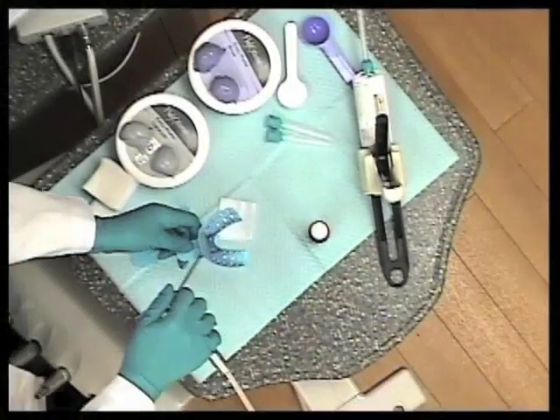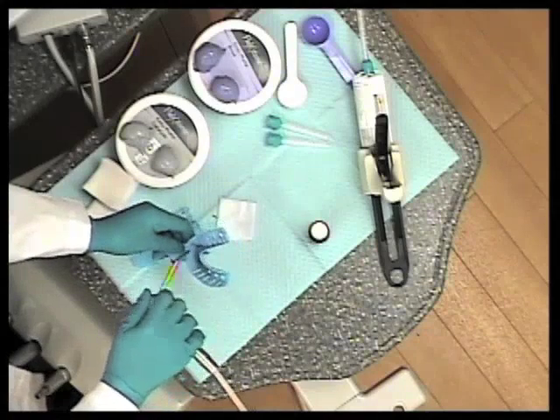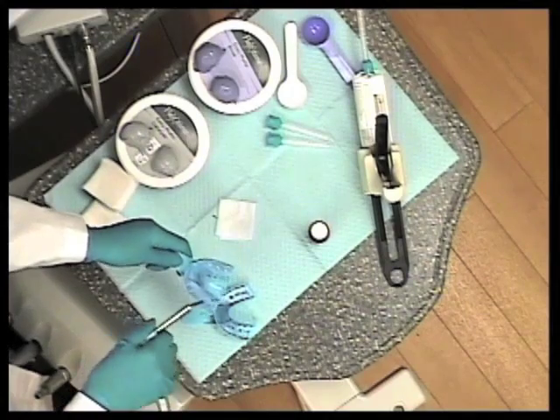Just make sure that when you apply this that you let it dry. Using a little stream of air can be very, very helpful. You just don't want to see any movement of the adhesive on the tray before you start mixing your material.